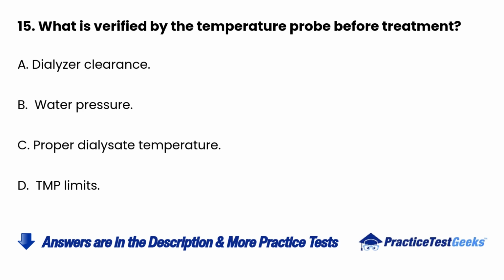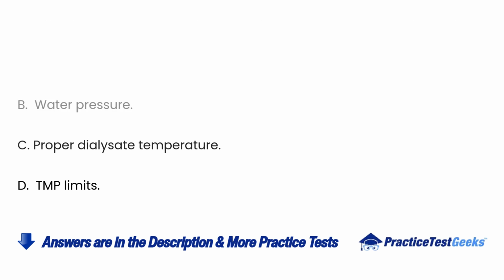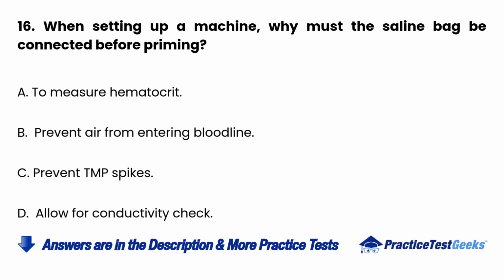15. What is verified by the temperature probe before treatment? A. Dialyzer clearance. B. Water pressure. C. Proper dialysate temperature. D. TMP limits.